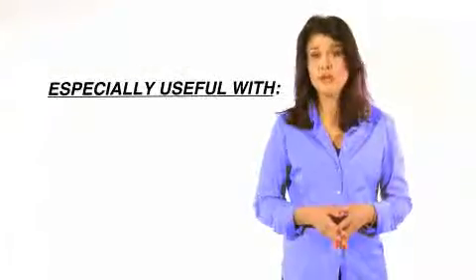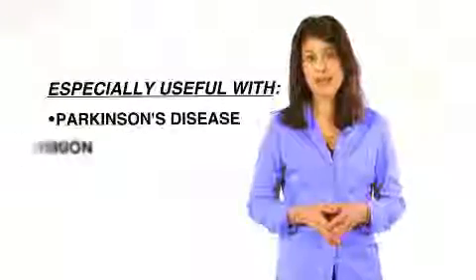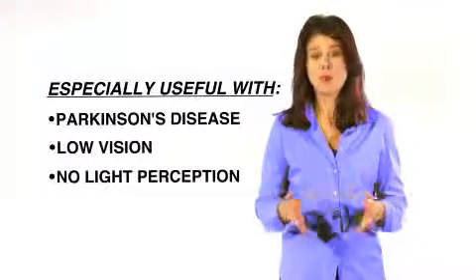A traditional eyedropper can prove to be difficult and frustrating because it requires you to use visual cues to put the drops in your eyes. This is especially true if you suffer from a debilitating ailment, making it a struggle to put the drops in correctly.